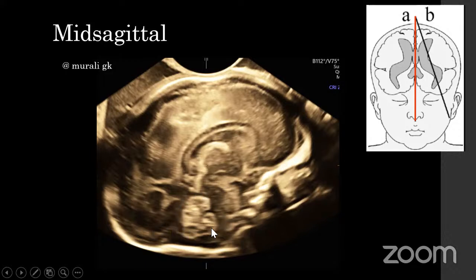Is nothing but the vermis of the cerebellar hemispheres. How do we describe the vermis? It is a kidney shaped structure which has a medial as well as a dorsal and a ventral margin. The ventral margin has an indentation called the fastigium. The dorsal margin has an indentation.